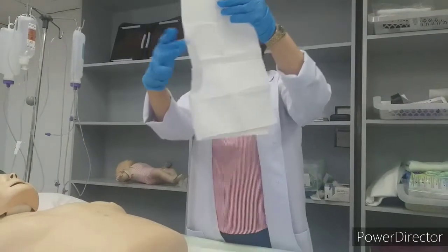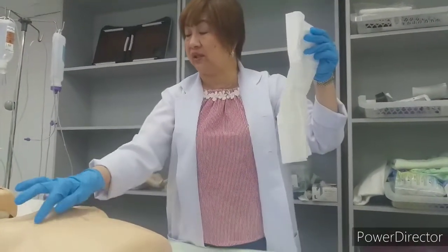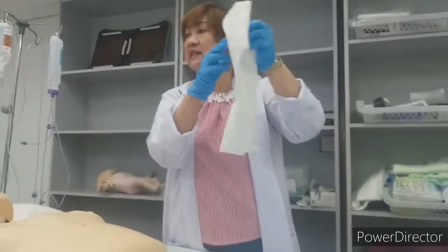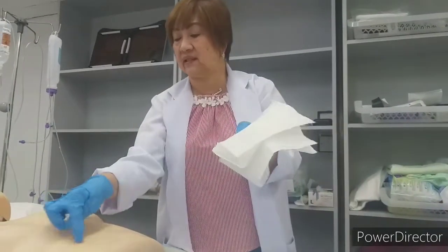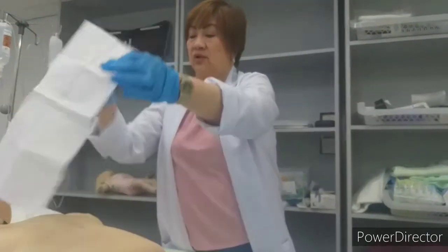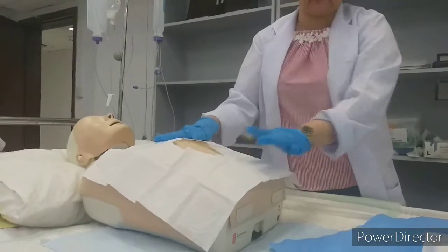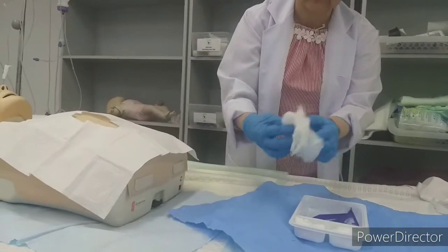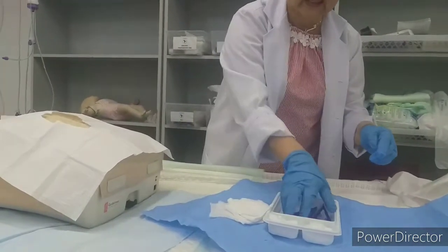So there should not be any cut. It depends on the patient's wound. If it is this long, cut this long. If this is so small, cut this small only. Okay, so it depends. So put it this way. Okay, keep other things out. On the field, this is a sterile field, so keep it aside.